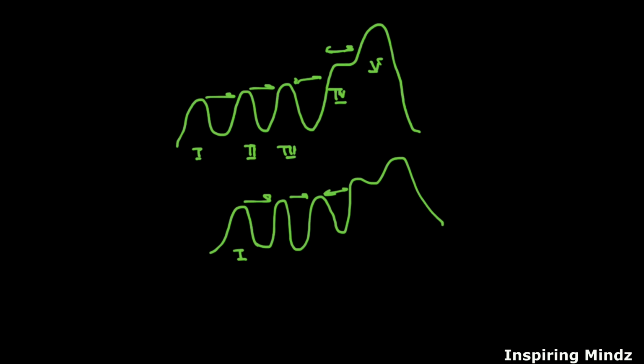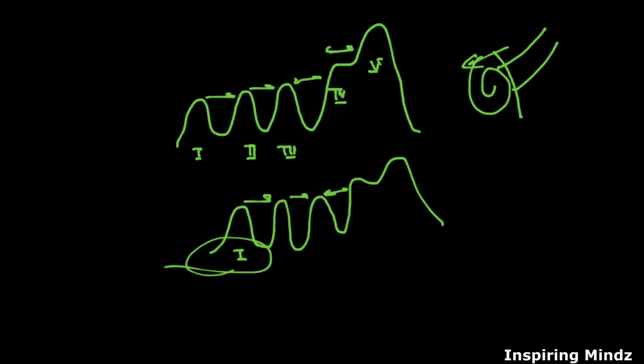You know that the first wave is from the distal portion of the cochlear nerve. That means there is some pathology before the distal portion of the cochlear nerve. So if this is your cochlea, this is your distal part of the cochlear nerve, some pathology is present before it, that is, in the inner ear or middle ear. You can remember this point. So if there is increased latency for wave 1, it indicates cochlear pathology.